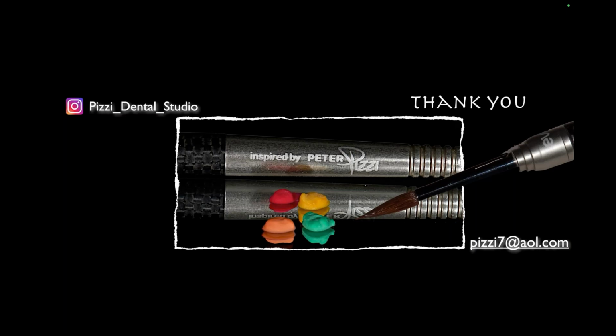So I still choose feldspathic for a lot of those, but I've shown many cases where we've used either lithium disilicate or the evolved material, Enamic, not Enamic, I'm sorry, Mark II, right? The Mark II material where I'm milling feldspathic and keeping it very thin. So there's a lot of ways to go, but it really depends on how much space I have, what's the prep shade, and what's the final coloration or the color underneath that I'm trying to fill.